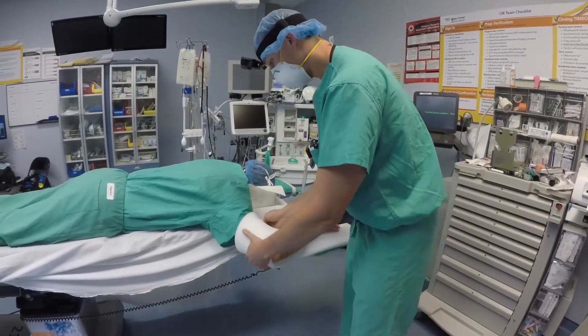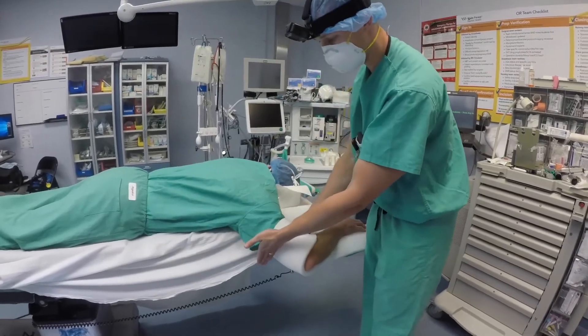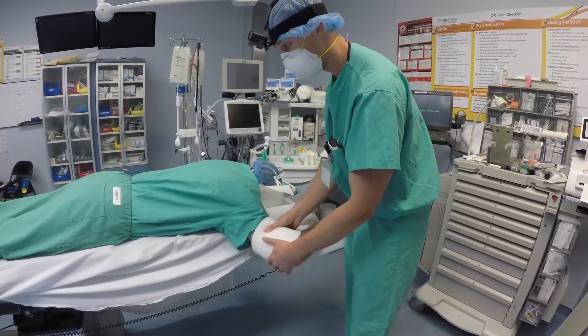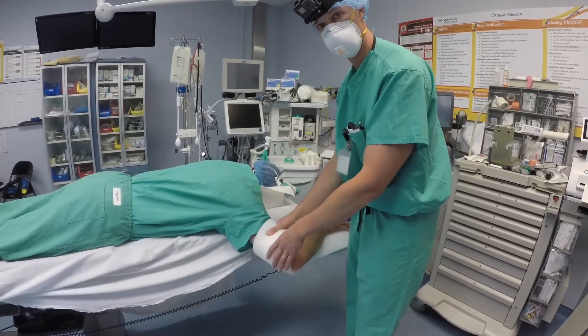The padding serves two purposes. When the C-arm comes up, if the image intensifier rests against his arm, it can hit the ulnar nerve, but it can also compress the radial nerve and the radial groove along the humerus. So you want to have a lot of padding and be cognizant of that as you're moving the C-arm back and forth.